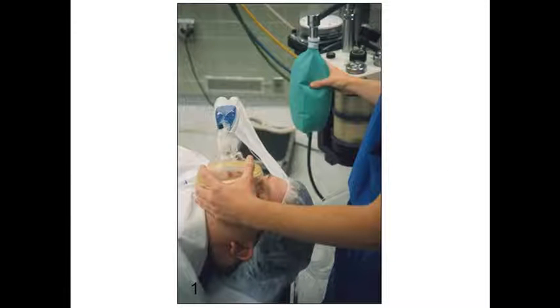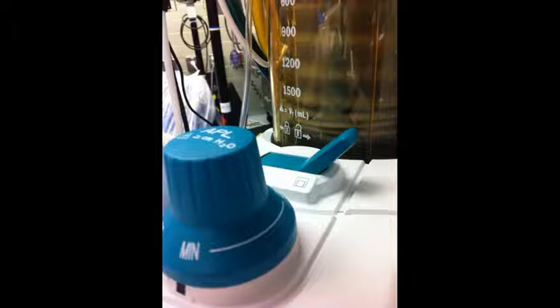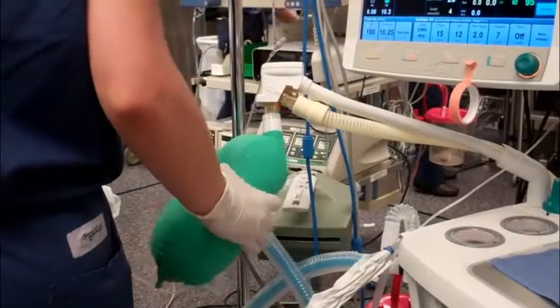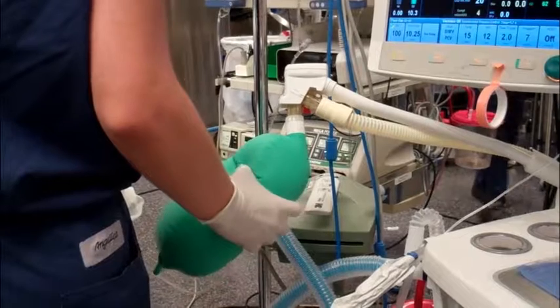There must be a certain degree of tension. The bag must be slightly taut in order to effectively ventilate. So you can adjust the tension in the wall of the bag by adjusting this valve. I also like to make the point that whatever the tension is in the wall of the bag that you're feeling, that's the tension in the wall of the alveoli that you're ventilating.